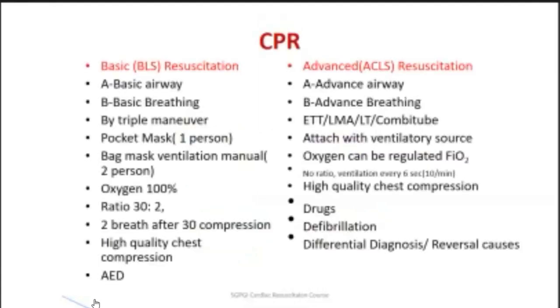So what is the difference between basic and advanced while managing airway and breathing? Basic airway: triple maneuver, use of oropharyngeal airway, and use oxygen as much as possible and when available during CPR. So in BLS, we are doing either pocket mask or bag mask ventilation. In advanced or ACLS, it is either using a supraglottic device, that is called advanced airway, or intubation. So intubation comes later on, it is not needed to start CPR. Or even doctors have confusion: call the anesthetist for CPR. The anesthetist is Superman, he will come in 30 seconds.